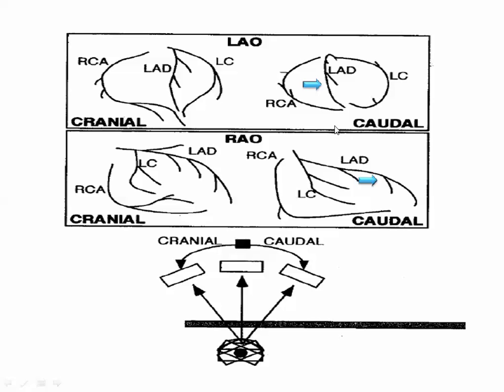So here it is the cranial, you can examine the mid and distal segment. Here is the caudal, you can examine the proximal segment of the LAD and the LCX and left main. Okay? Is it clear or not?